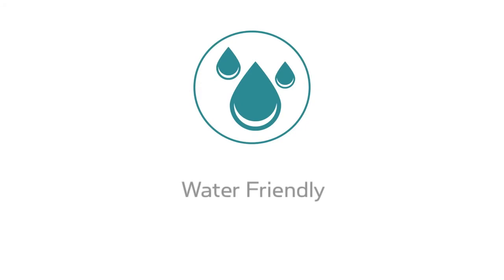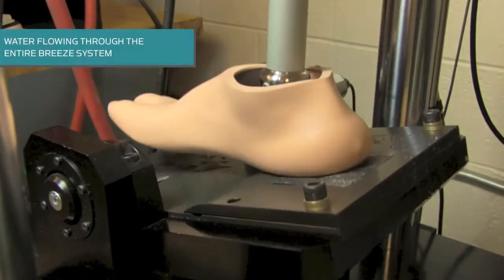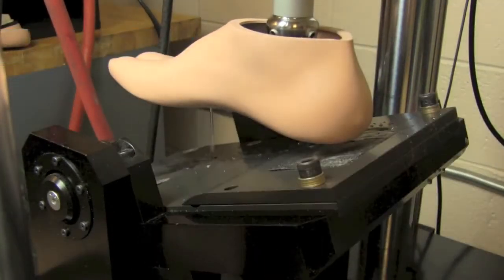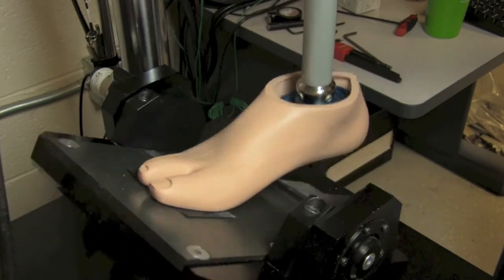The Breeze Foot was also designed to be completely water friendly. It features an optional water drain port, corrosion resistant materials, and special modifications to clear water from the entire prosthetic system. This makes the foot a great option for the shower or beach while still providing full function.